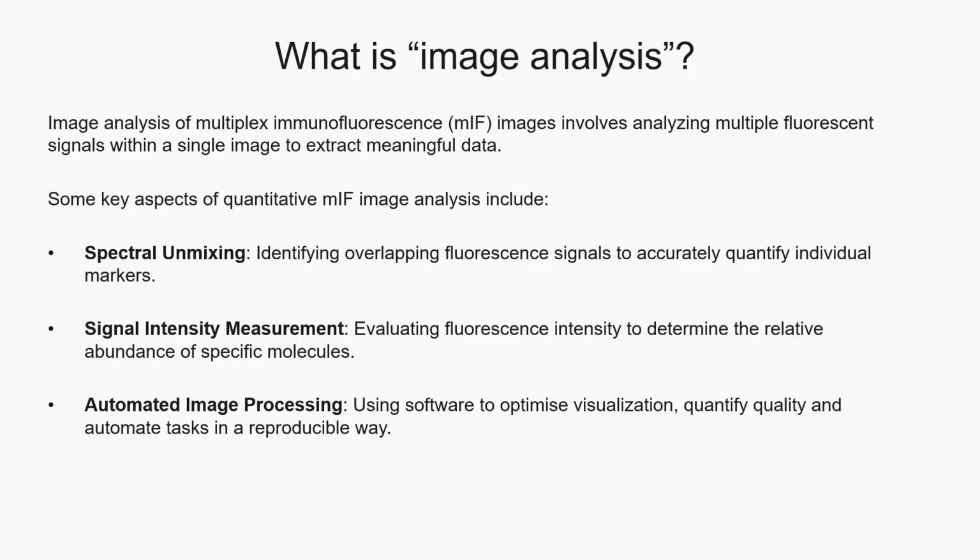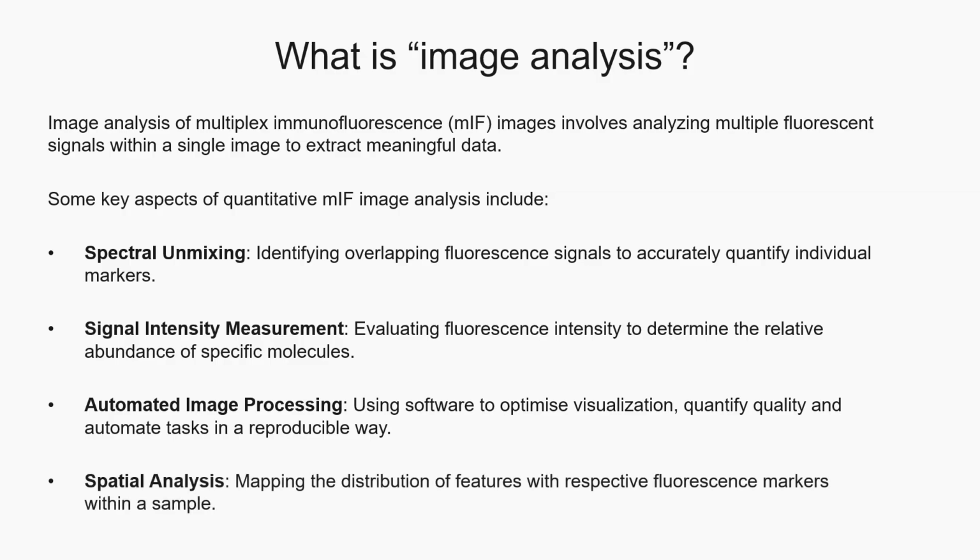Image analysis also considers automation and how we can use software and computers to automatically visualize, identify, quantify, and measure our images. And then how can we understand the spatial relationship of these different fluorescent signals in the biology we are interested in.